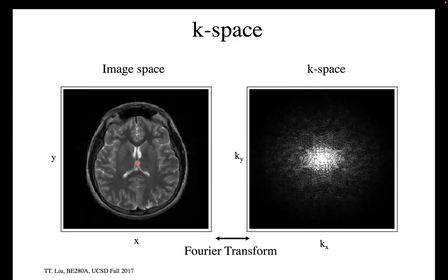And what actually happens with that pulse sequence, what it produces for us, is this thing. This is the signal we measure. And this turns out to be the Fourier transform of this thing. So you take this thing and you look at it and you say, what's its Fourier transform here? This is the raw data that you're going to collect. And I know that sounds a little magical, but we'll perhaps get to the point where we understand that just by looking at a little bit of simple math.